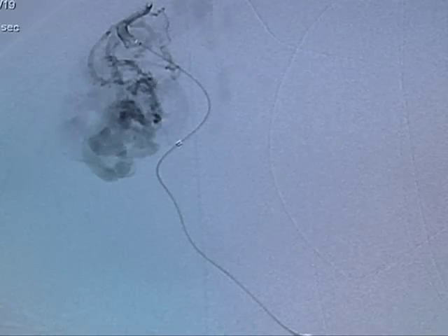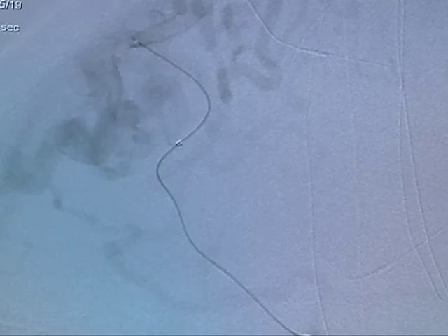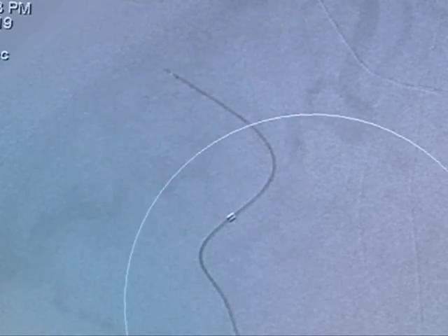Here is a view. The catheter has been advanced quite distally. The AVM only is opacifying. We have determined that our catheter position is good for this portion of the embolization. We will now go ahead and begin to inject the Onyx-18, which is the black material that is appearing on the screen.